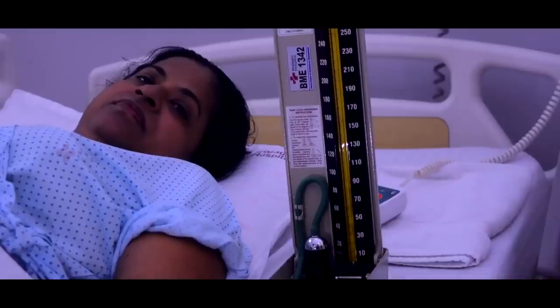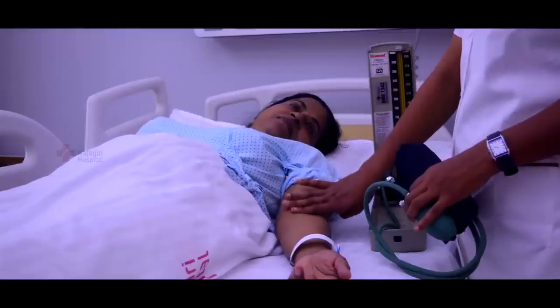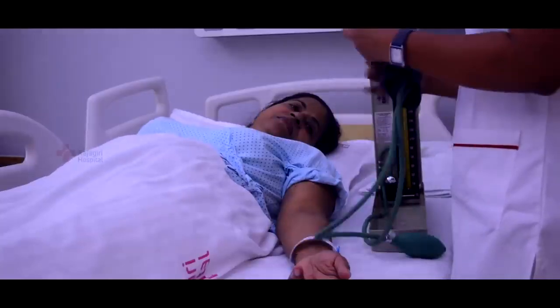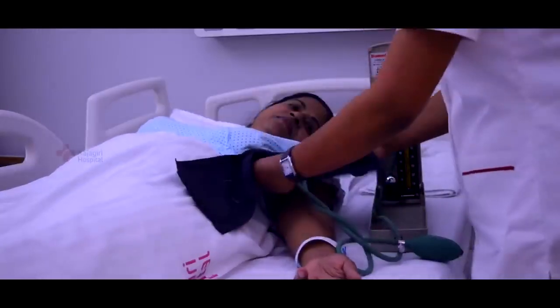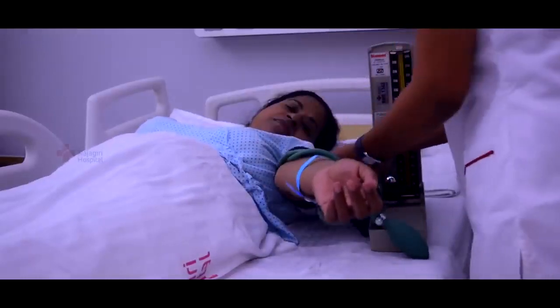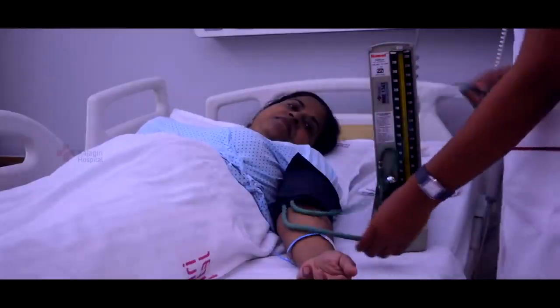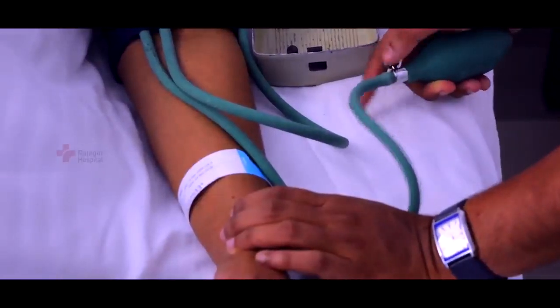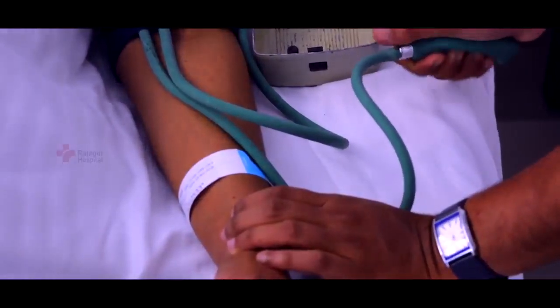Place the lower border of the cuff approximately 2 to 3 fingers above the antecubital space. Wrap the deflated cuff around the upper arm. Perform a preliminary palpatory determination of systolic pressure by palpating the radial artery.